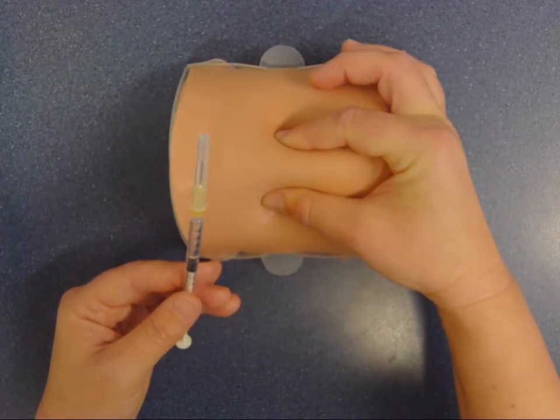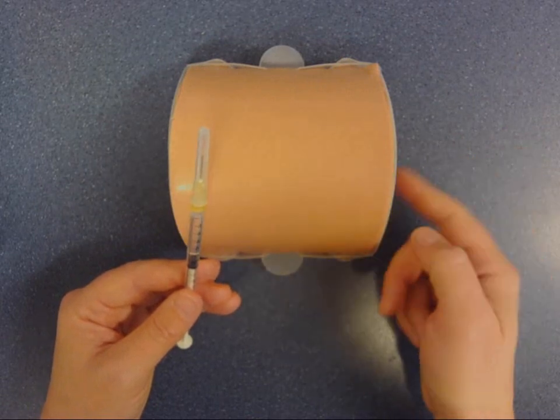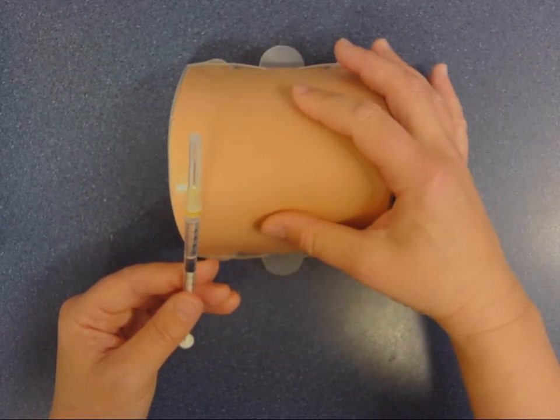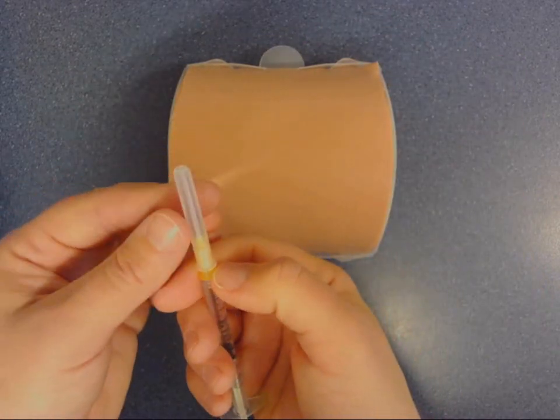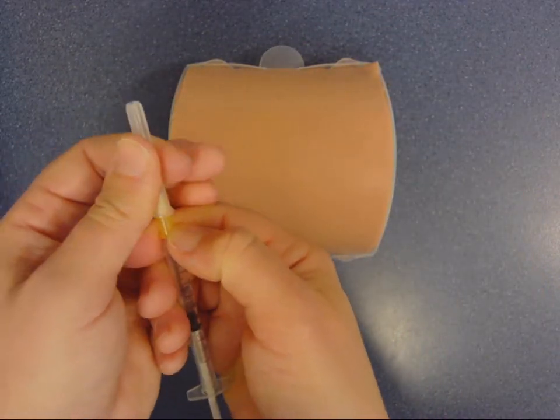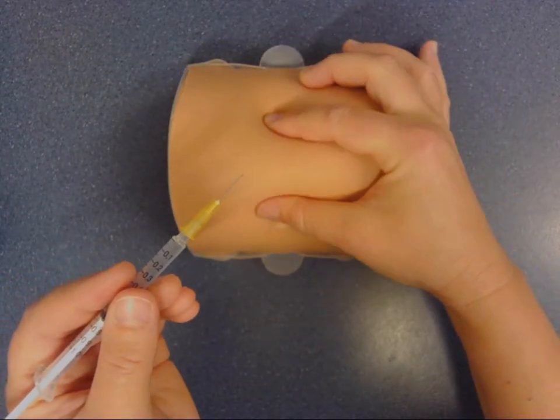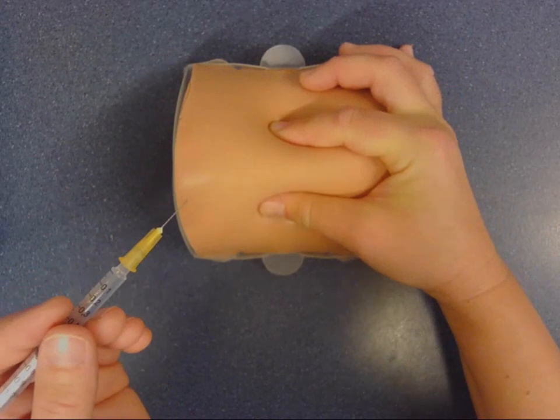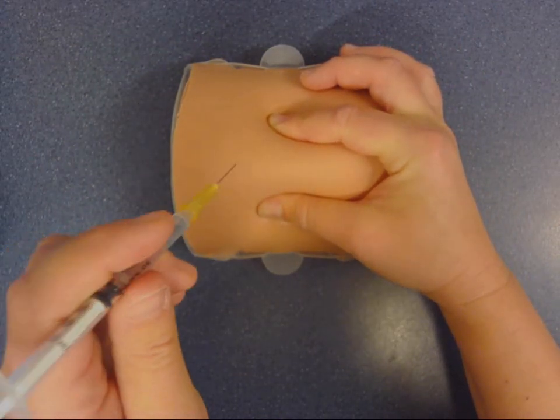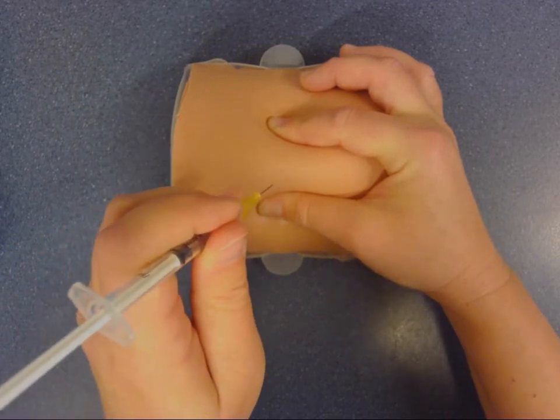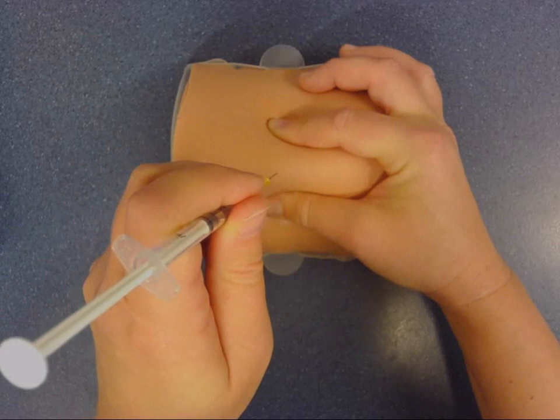I'm pinching the skin in order to separate the subcutaneous layer from the layer of muscle to ensure that I actually do inject into the layer of fat. So I'm going to pinch the skin with my non-dominant hand and I'm going to hold the syringe like a dart. And I'm going to inject the drug at a 90 degree angle.